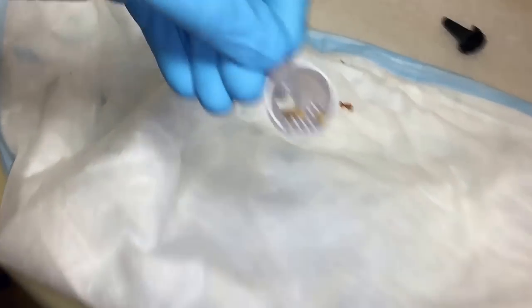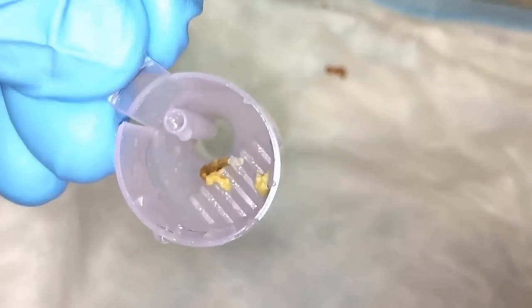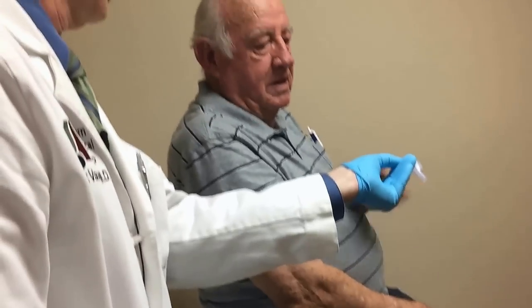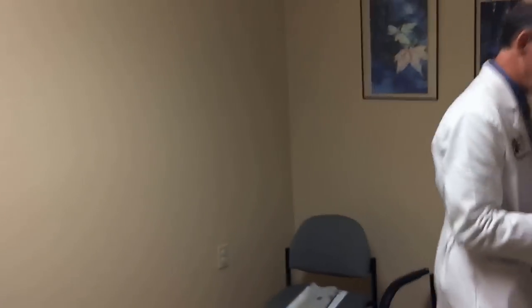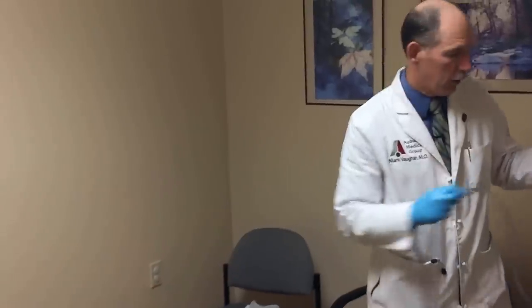There's a little bit in there, not a whole lot. See, it captured a little bit of it. It looks like quite a bit — that one big chunk down in there. Not a hundred percent, but if you use the hydrogen peroxide with water and let that soak in there for 15 minutes twice a day for the next week or so, that's going to help that to soften up and come out.